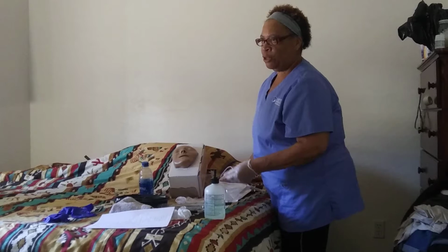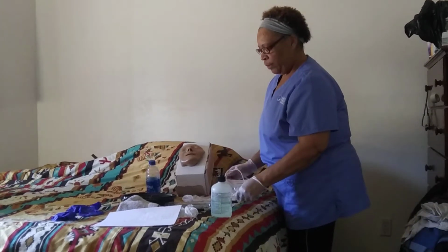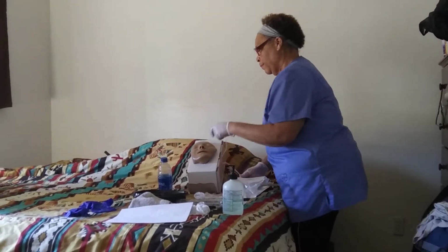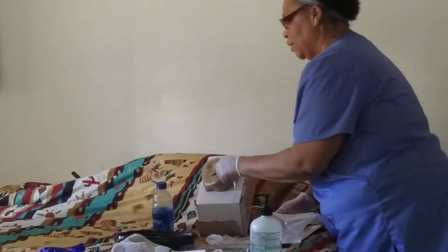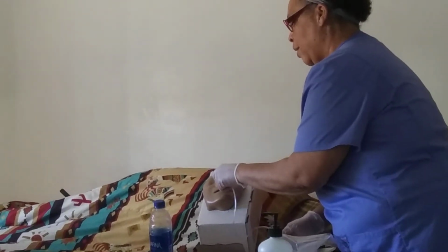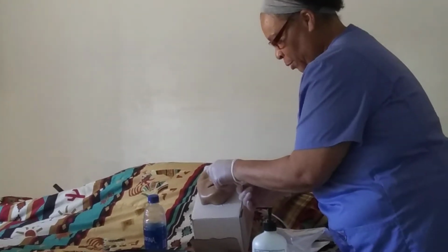I take the lube. And at this point, I also have an assistant coming to help me, and that assistant will be giving the patient water as I'm inserting the nasogastric tubing. So I'm going to lube my nasogastric tube, and then I would gently push it, insert it towards the back smoothly, so it's going in and then going down. As it's coming down the throat, I'd have the patient tilt his head forward for easier insertion.